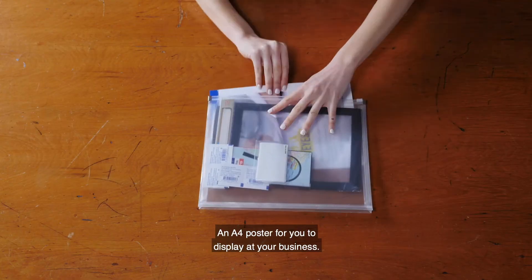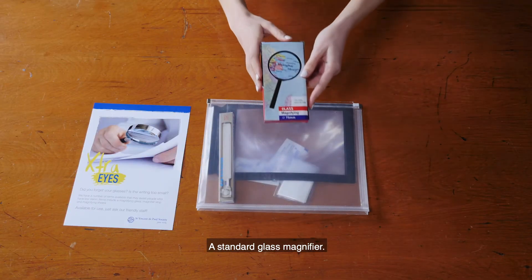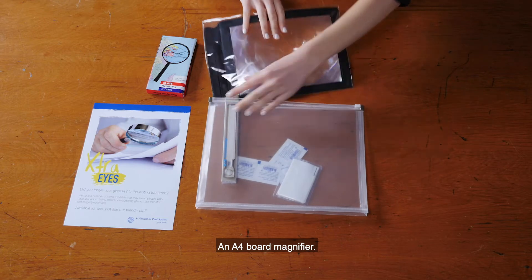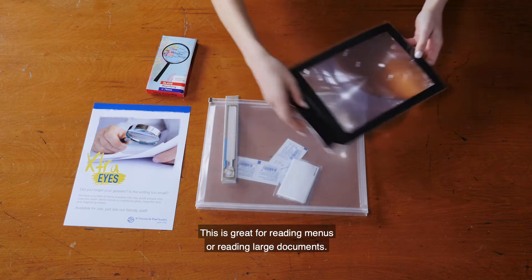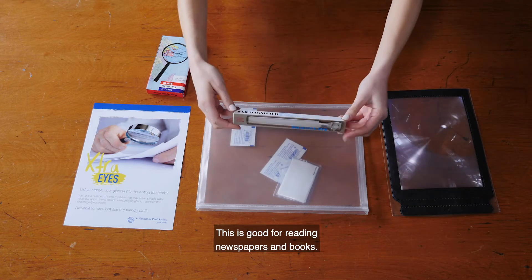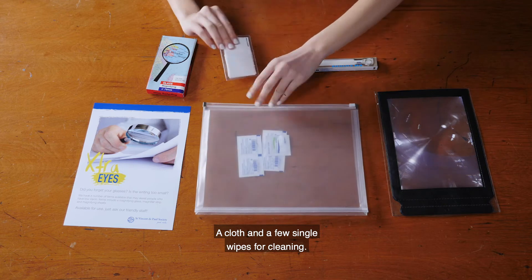Here's what is in the kit: an A4 poster for you to display at your business, a standard glass magnifier, an A4 board magnifier — great for reading menus or large documents — a vision bar, which is good for reading newspapers and books, and a cloth and a few single wipes for cleaning.